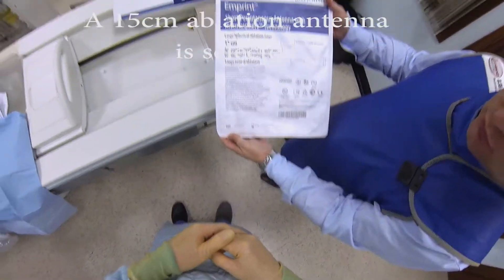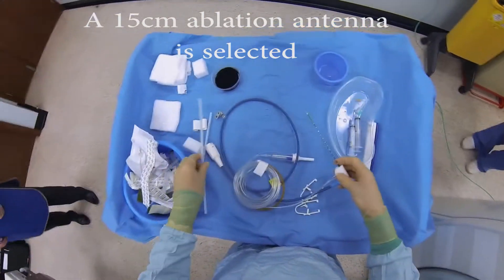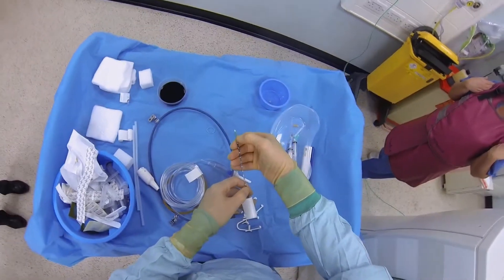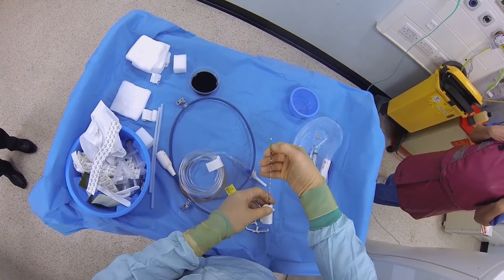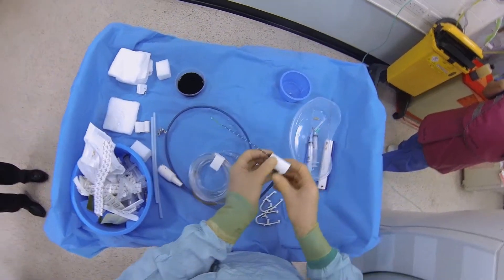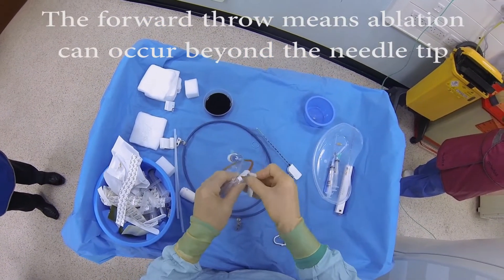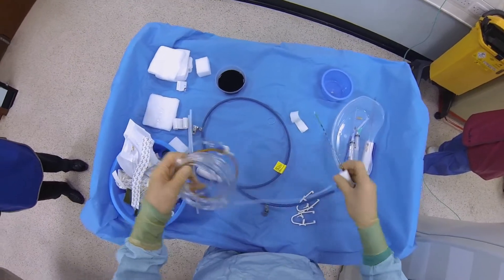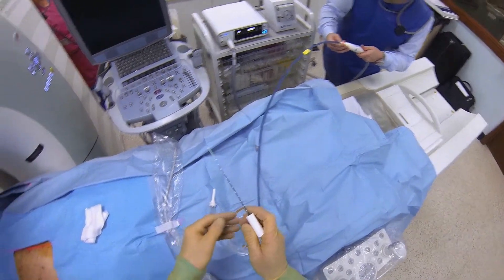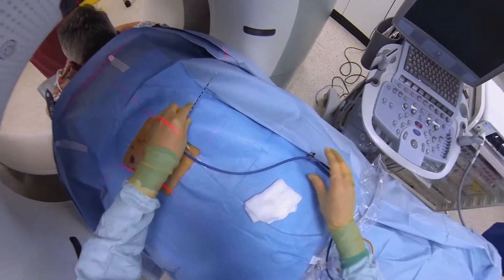Right, 15cm — that's fine. So it's a 15cm Covidien Emprint microwave antenna, and the feed point is midway down the green part on this length of the electrode, and it has a slight forward throw just beyond the tip. This tubing here is for cooling and it's just going to be connected to a bag of saline, which can be at room temperature — that's the feed for the antenna. And we can check the antenna is all functional.